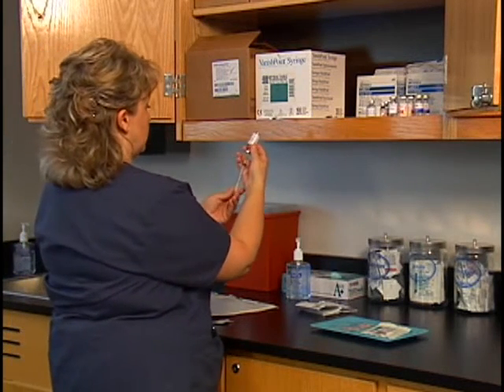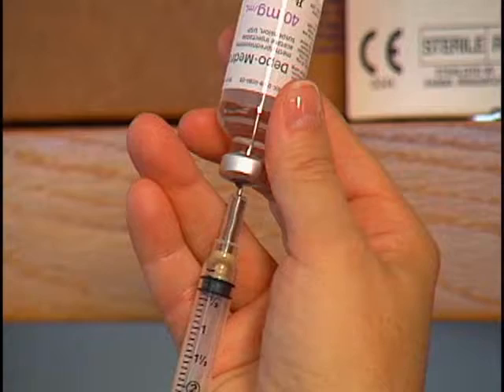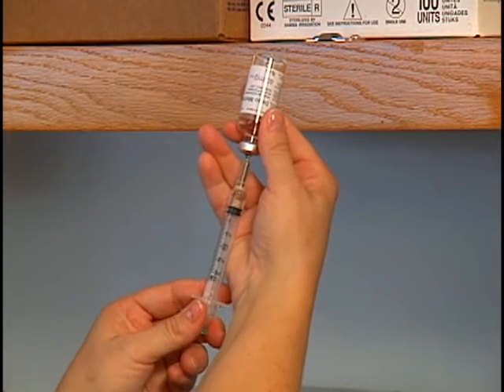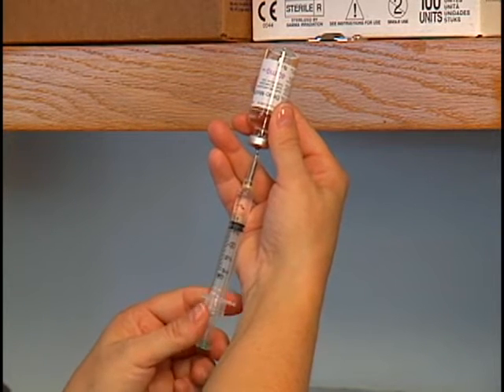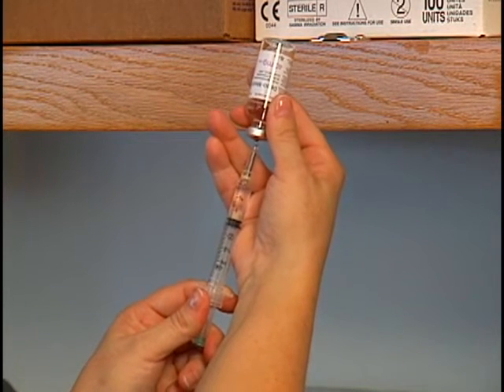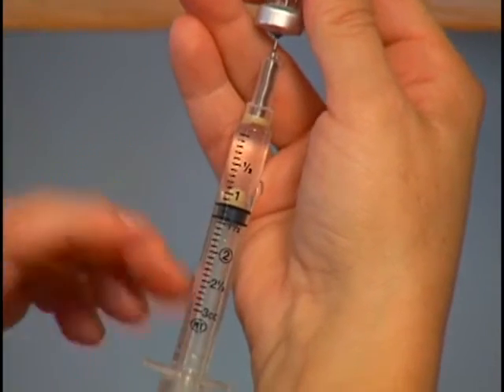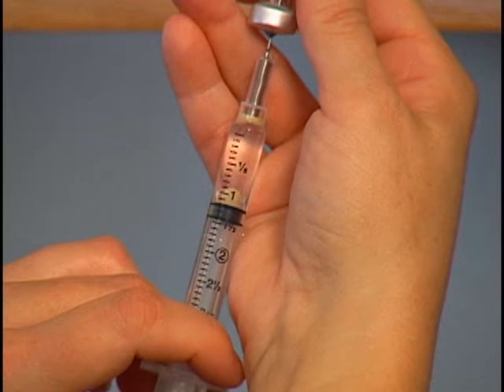Invert the vial while holding onto the syringe and plunger. Keep the needle opening below the fluid level to prevent drawing air into the syringe. Hold the syringe at eye level and withdraw the proper amount of medication into the syringe. Remove any air bubbles in the syringe by holding the syringe in a vertical position and tapping the barrel with the fingertips until they disappear. Air bubbles take up space the medication should occupy, which prevents the patient from getting the proper dose of medication.